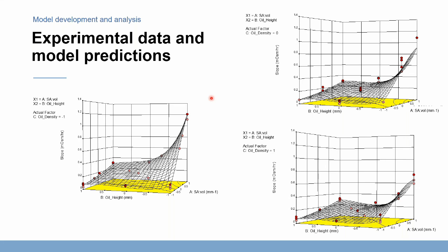Okay. And John also had a question. How did you vary the surface area to volume ratio? Was it just by changing the volume of liquid in the cup with the surface area of the liquid to oil interface remaining constant? That's exactly how I did it.